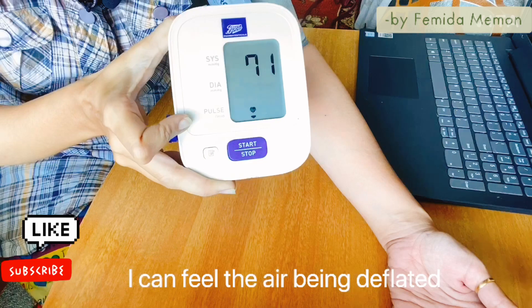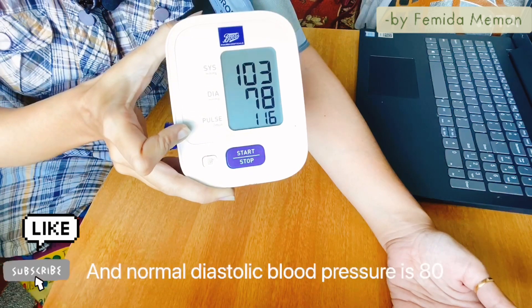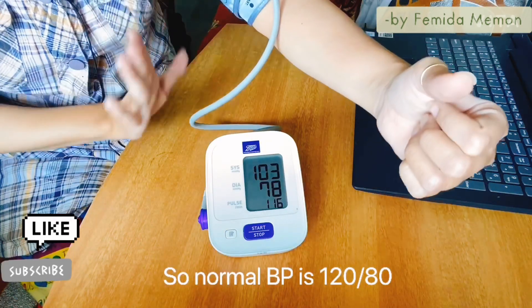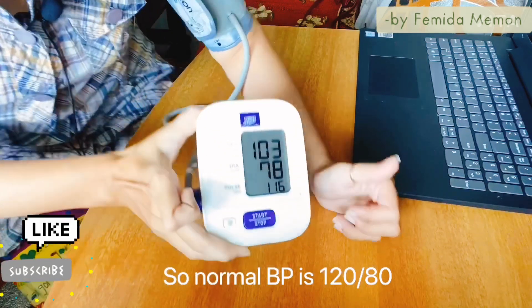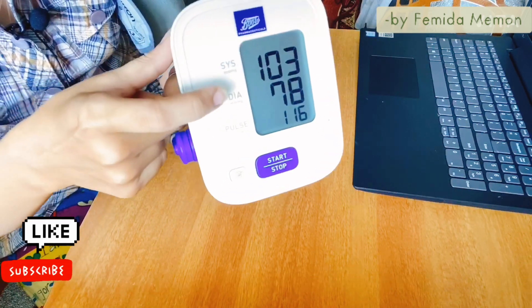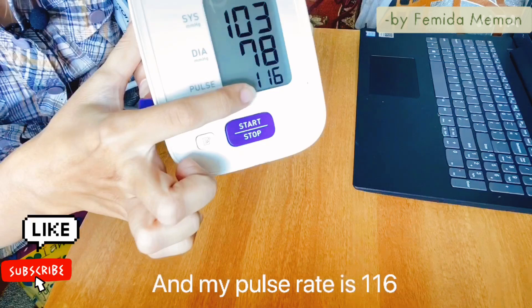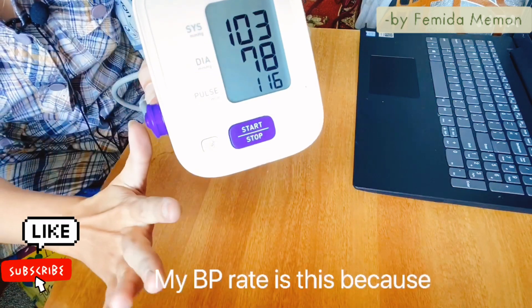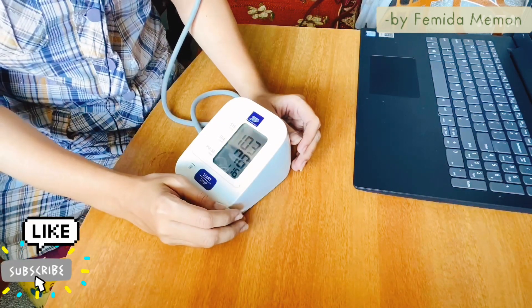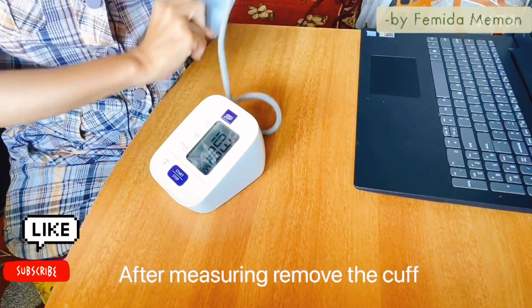Here is my blood pressure — it is 103 by 78. Normal systolic blood pressure is 120 and normal diastolic blood pressure is 80. My systolic blood pressure is 103, diastolic blood pressure is 78, and my pulse rate is 116. My BP is like this because I have not eaten anything since last night — I am making this video early morning. Now you can remove the cuff after the measurement.